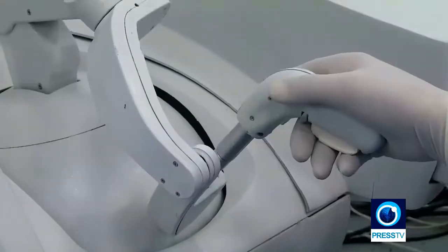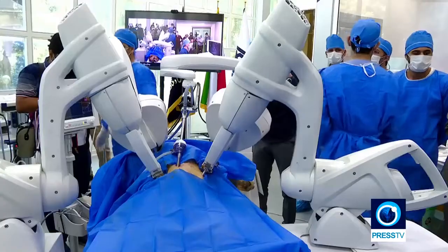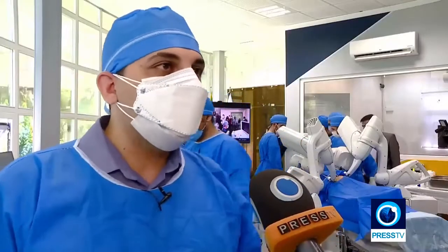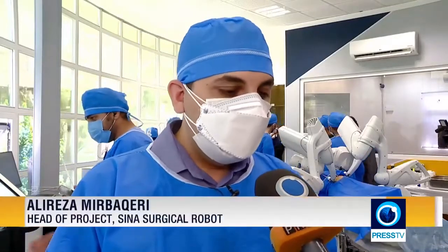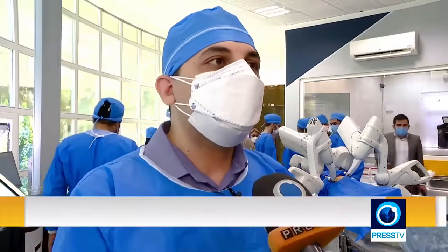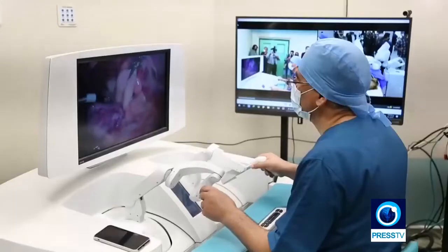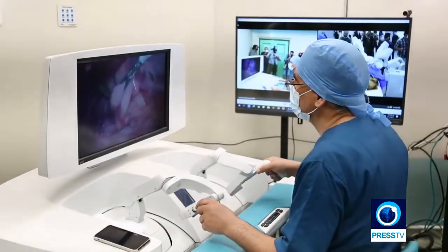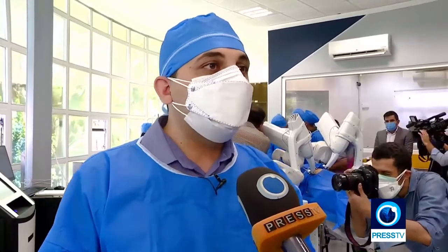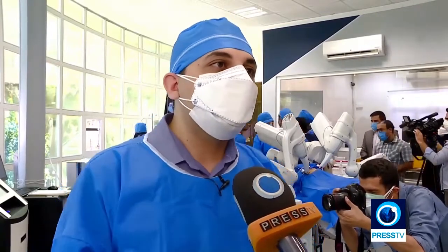The surgeon robot has 2 main subsystems, including a master robotic console at the surgeon's side and a slave robotic system at the patient's side, which are connected through a 5G wireless network. The human surgeon sits behind the surgery console, gets some handles, and starts surgery through a vision seen through the cameraman robots, which send the intra-abdominal visions to the screen in front of the surgeon. So the surgeon starts surgery using his handles. The surgery console receives the movements of the surgeon's hands and transmits them to the surgery robots.